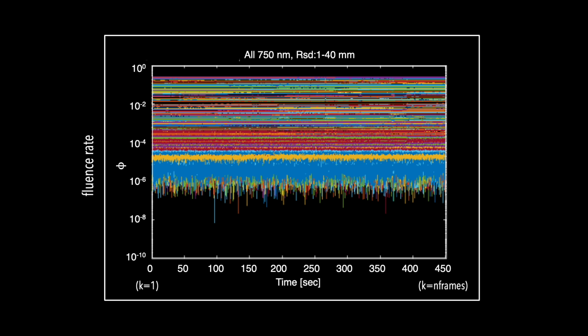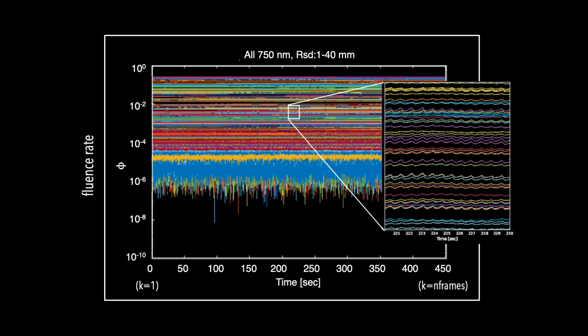The plot shows a selection of source detector pair measurements from the array. Because the traces tend to overlap, the content can be somewhat confusing. A handful of traces is shown expanded in the inset appearing here. Each trace represents one source detector pair measurement, which we will sometimes call a channel in what follows.